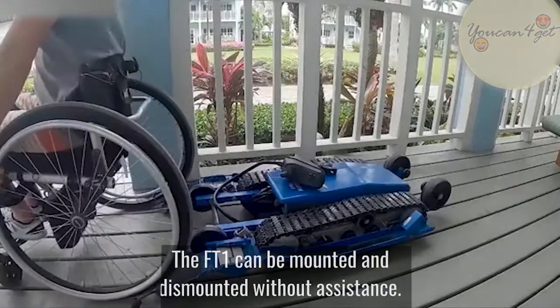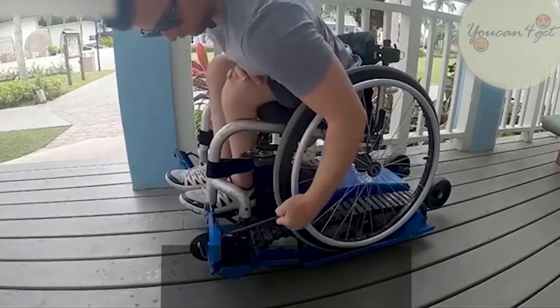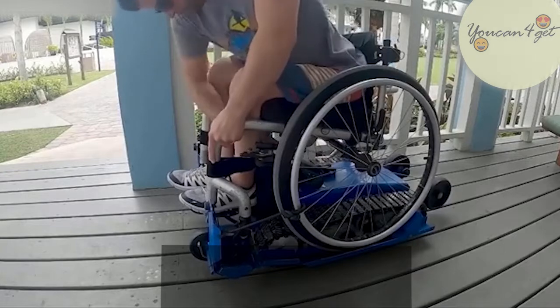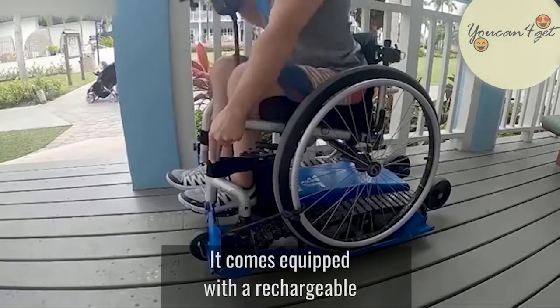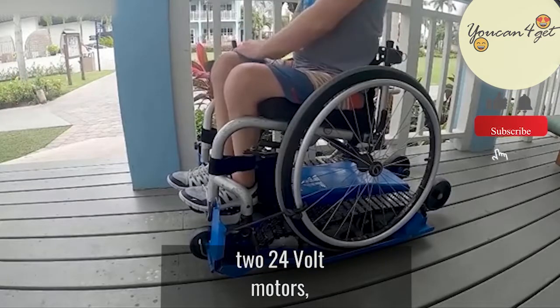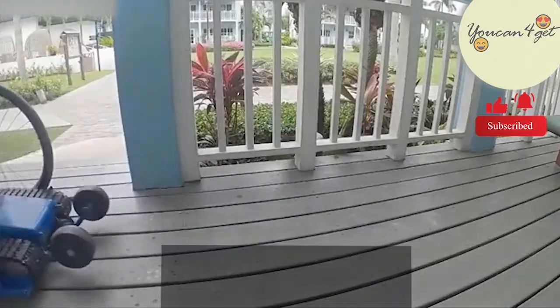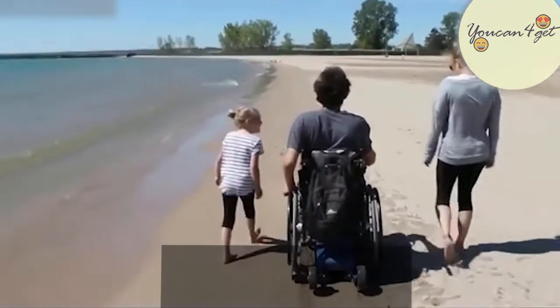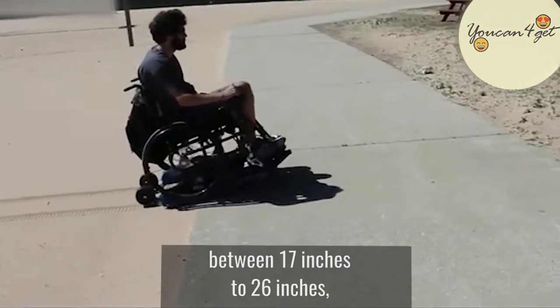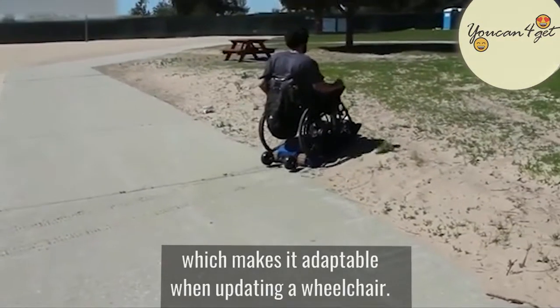The FT1 can be mounted and dismounted without assistance. It comes equipped with a rechargeable 24-volt lithium-ion battery, two 24-volt motors, a handheld joystick, and a charger. It's adjustable for wheel widths between 17 inches to 26 inches, which makes it adaptable when updating a wheelchair.